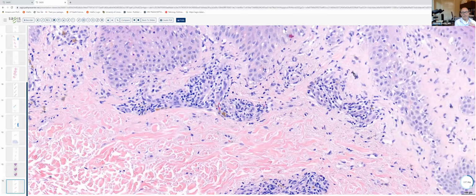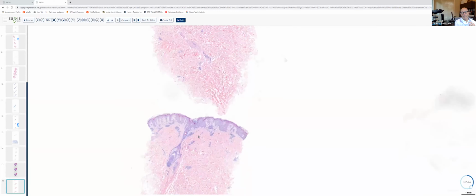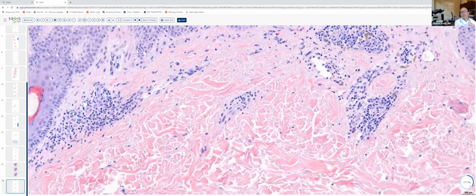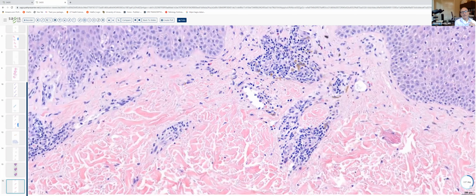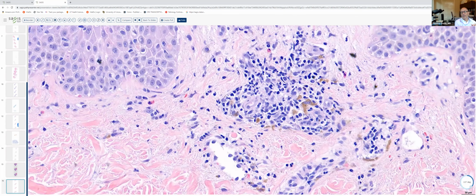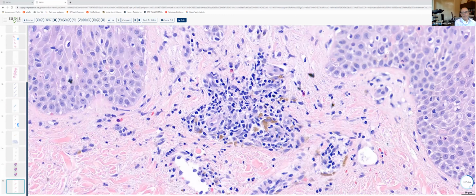Yeah, let's go down and take a look at the other piece within the infiltrate. And when we begin to see these changes, vacuolar change, necrotic keratinocytes, and an infiltrate with lymphocytes, pigmentary incontinence, and numerous eosinophils, obviously fixed drug eruption moves much higher on the list.